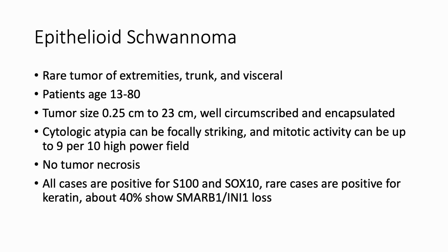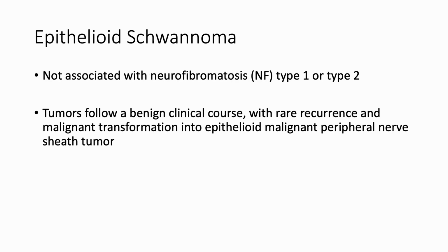Immunohistochemically, all tumors are diffusely positive for S100 and SOX10, and approximately 40% show INI1 loss. Clinically, they are not associated with NF1 or NF2. Most epithelioid schwannomas behave in a benign fashion. However, rare tumors may recur or undergo malignant transformation into low-grade epithelioid MPNST.